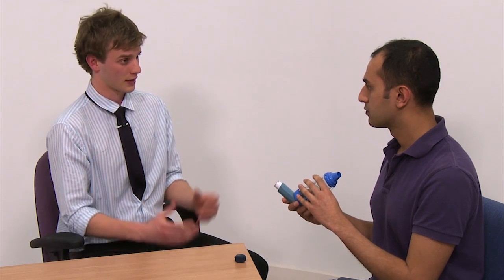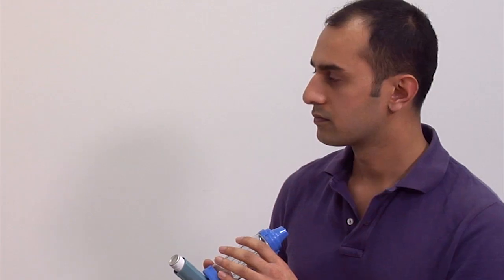Now, just as before, take a breath out, put the mouthpiece into your mouth between your teeth — but not biting it — and make sure that you've got a nice seal around the mouthpiece with your lips. Then start to take in a slow, steady breath, release the medication, and continue that breath until your lungs are completely full.